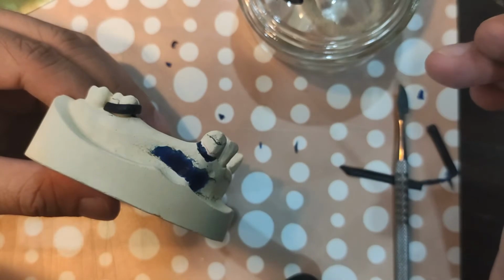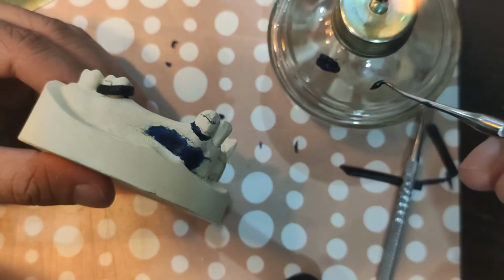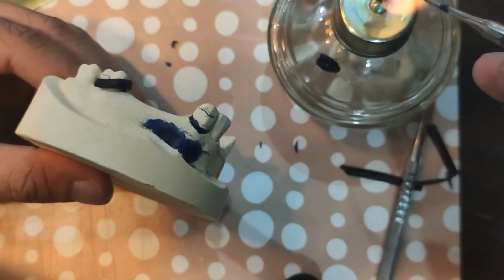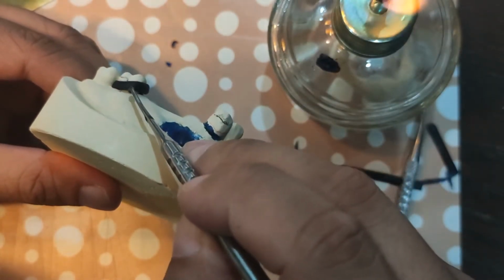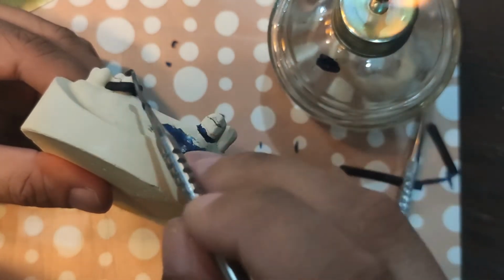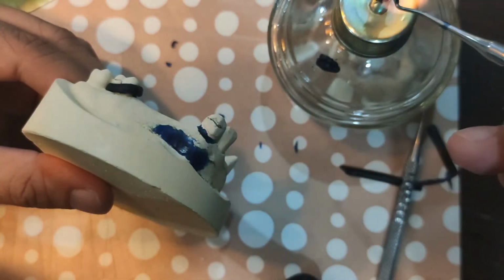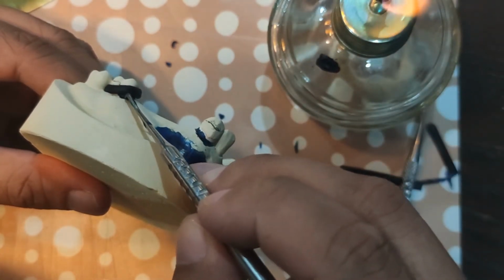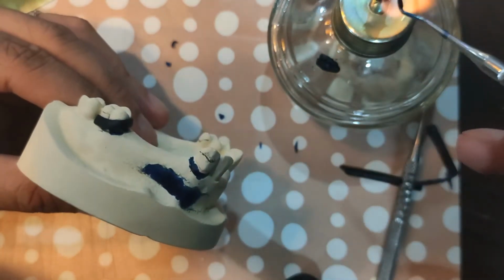We lute the inferior border. I always have a piece of wax right where the alcohol lamp is, para yun yung ginagawa kong well. There, the ledge is luted.